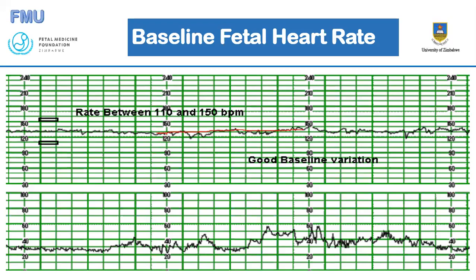So that gives us about 130 here. So 130 will be the heartbeat in this case. So 130 beats per minute will be the baby's heart rate, the baseline heart rate. You can see that in the segment which I chose, there are no accelerations and there are no decelerations. I'll show you what accelerations and decelerations are.